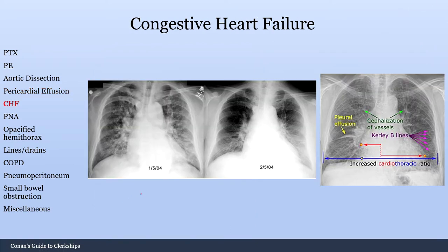Next, let's move on to congestive heart failure. On the left, you have somebody with a CHF exacerbation — you can see bilateral fluffy infiltrates throughout, with hilar fullness and pulmonary vascular congestion. People generally describe this as a wet X-ray. On the right is a month later when the patient's CHF has improved — a relatively dry radiograph compared to the prior X-ray.